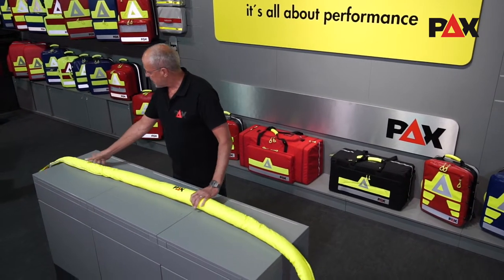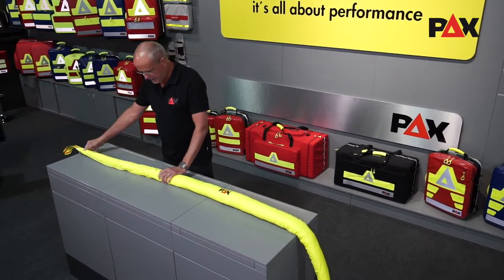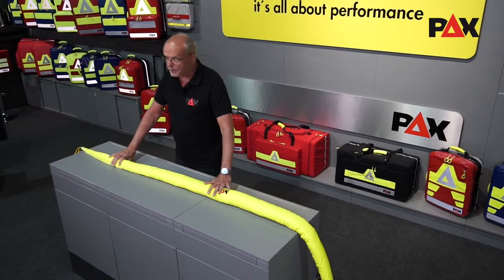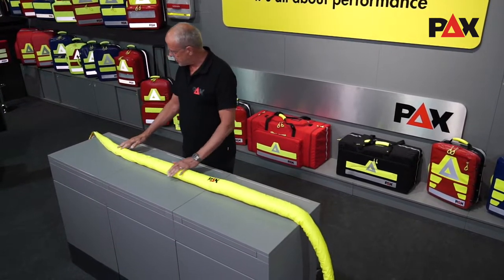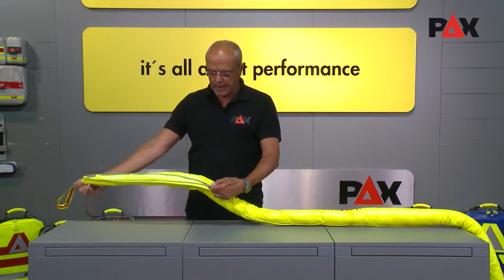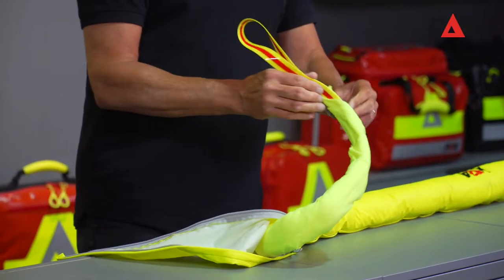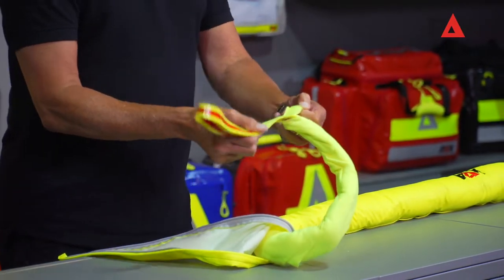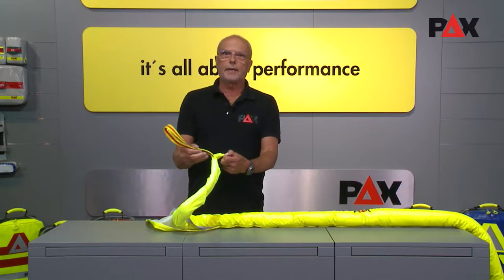It is constructed with an outer material that is very easy to clean. This outer material originates from aircraft construction — it was originally used to make seat covers. You can separate this outer material from the inside with a zipper, and inside you can see a blanket that can also be used to keep warm.